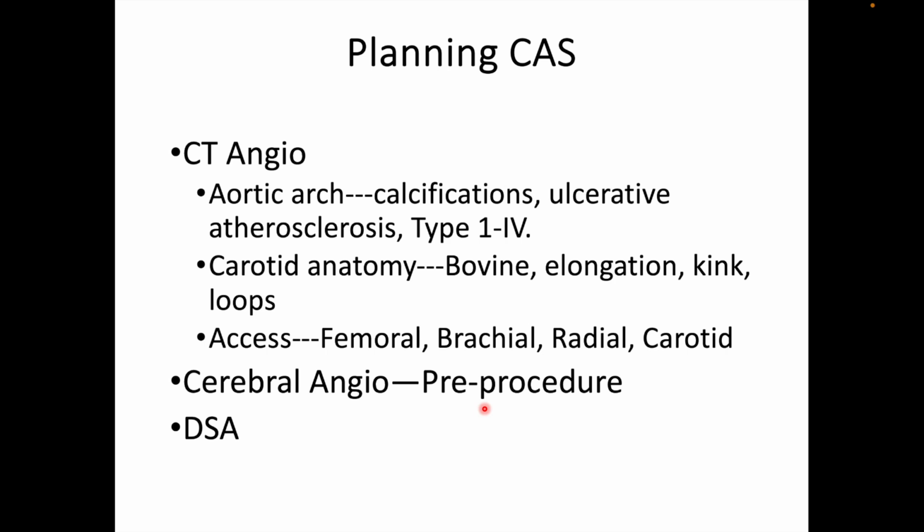Then decide your access depending on the anatomy. Should you go femoral, brachial, radial, or direct carotid? But direct carotid, remember, is a bailout strategy. Then cerebral angio pre-procedure is a must.